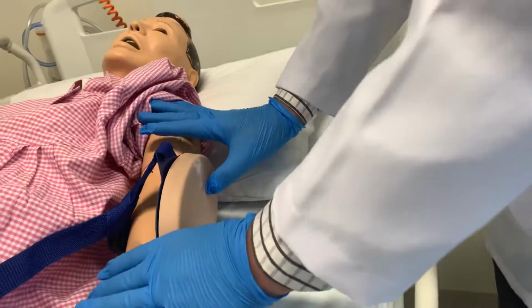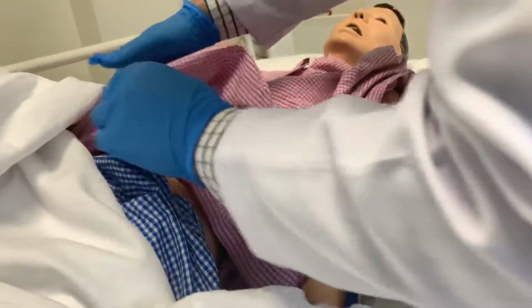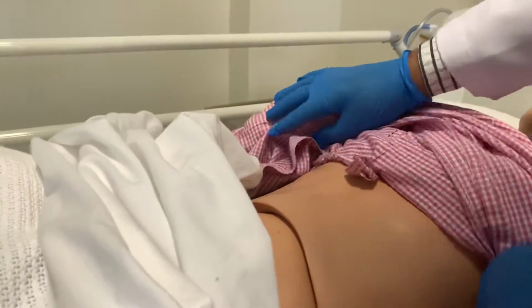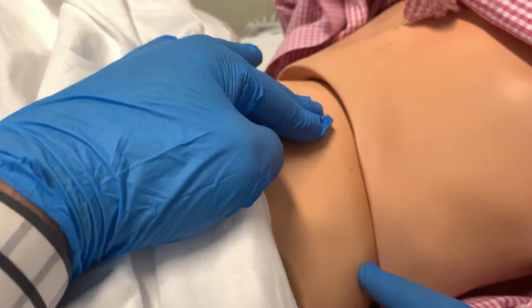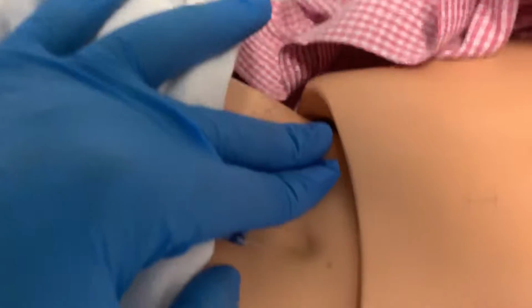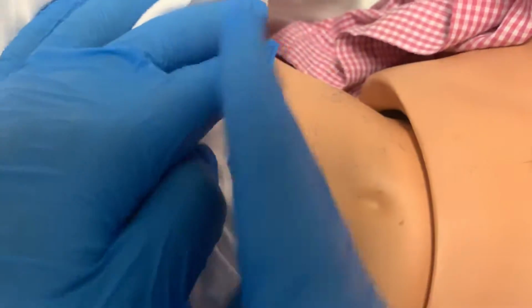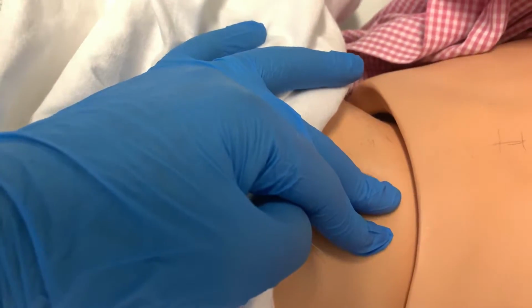The second area to give is the abdomen, and we can take the umbilicus as a landmark. From the umbilicus, you can put two fingers, so this will be the area to give, or here, and that area over here. I will not give in this area. Only two fingers to the right, two fingers to the left.